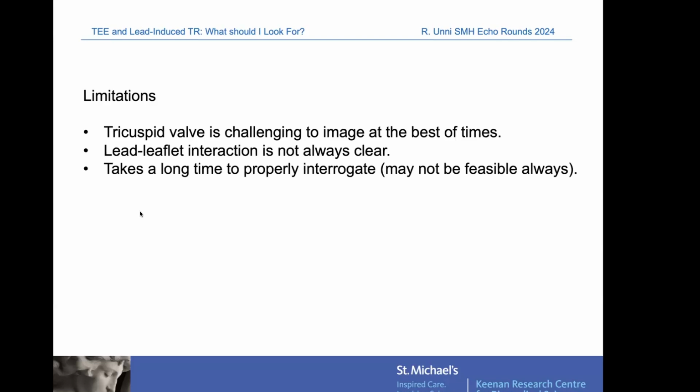It does take a long time to properly interrogate. I know in some of the labs out there, you guys are doing 5 or 6 TEs per day, and you don't have the luxury of spending an hour on the tricuspid valve like I do. So it's certainly not feasible always.